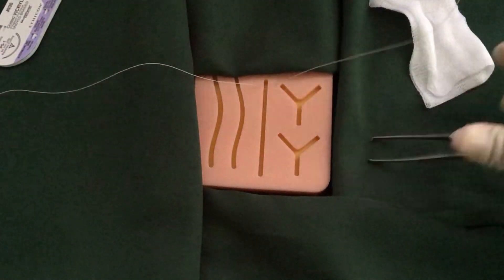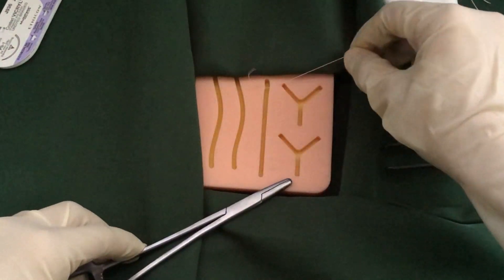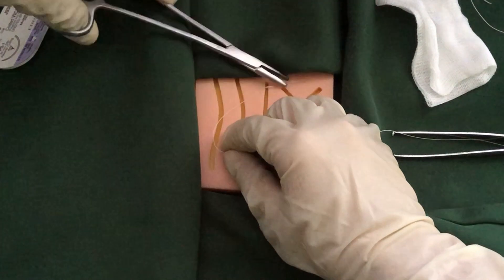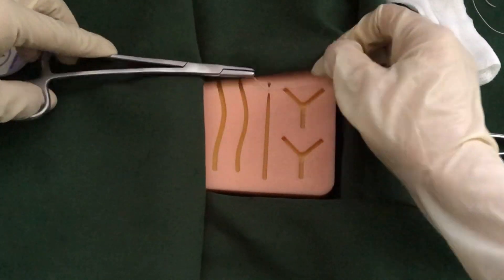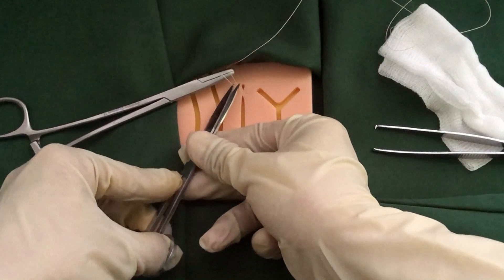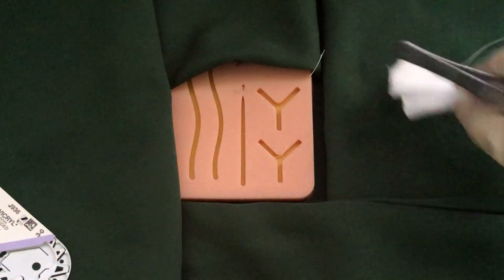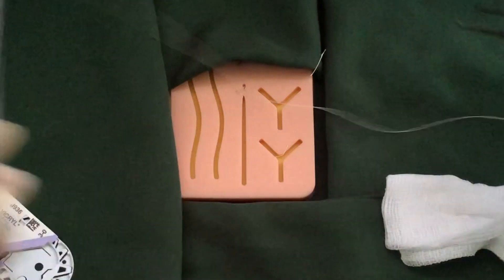Gently rotate your wrist following the arc of the needle until it exits on the other side of the wound. Then adjust the length of the suture. Form an instrument tie or a square knot. The knots are usually placed on one side so as not to disrupt the healing process of the wound. Use the suture scissors to cut the suture 1cm from the knot. The procedure is repeated along the entire length of the wound.